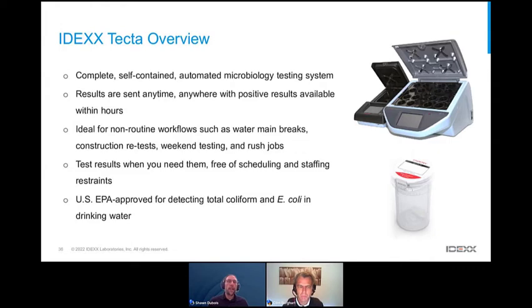The system can also email results to users, so they can have the result without having to actually come in to read from the machine.